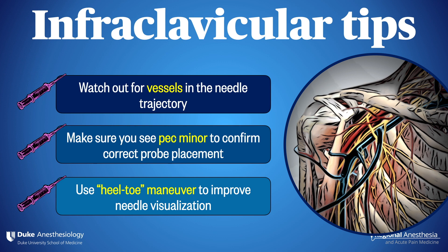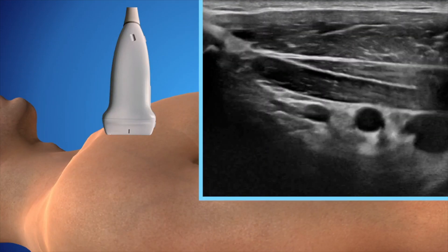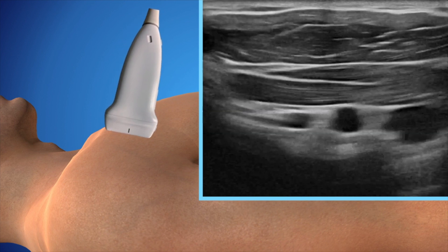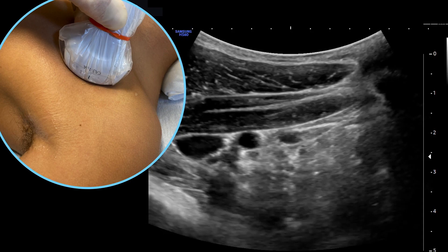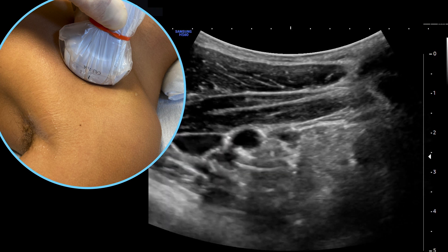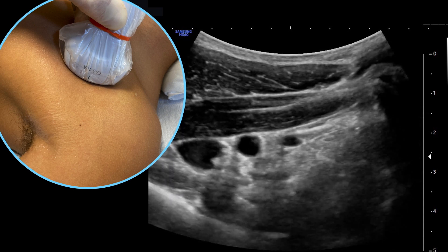A criticism of the infraclavicular approach is that it's relatively steep and deep, which makes it difficult to see the needle at times. Heel-toeing the probe so the beam is angled more towards the head may only change the angle by 10 to 15 degrees, but this vastly improves the likelihood you'll see your needle. Alternatively, we'll pull out the curvilinear probe sometimes, especially for patients with a lot of pec muscle — the fan-shaped angle of the beam can improve needle visualization, especially in heavy patients.